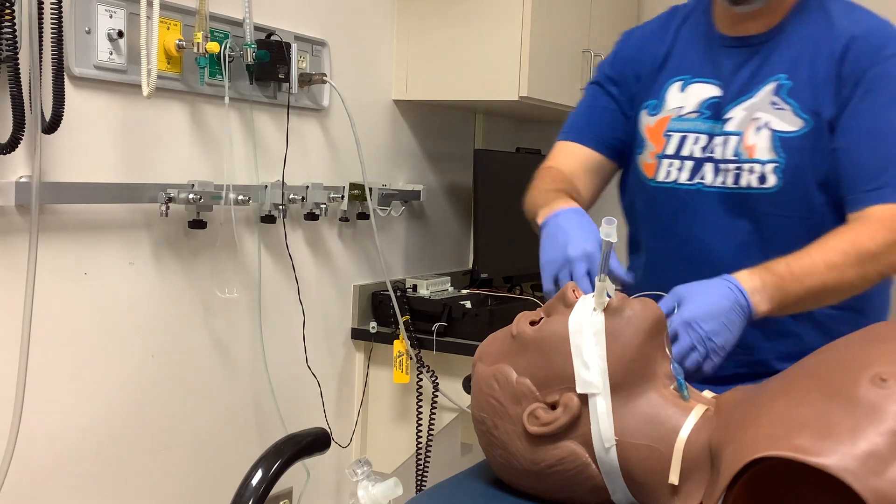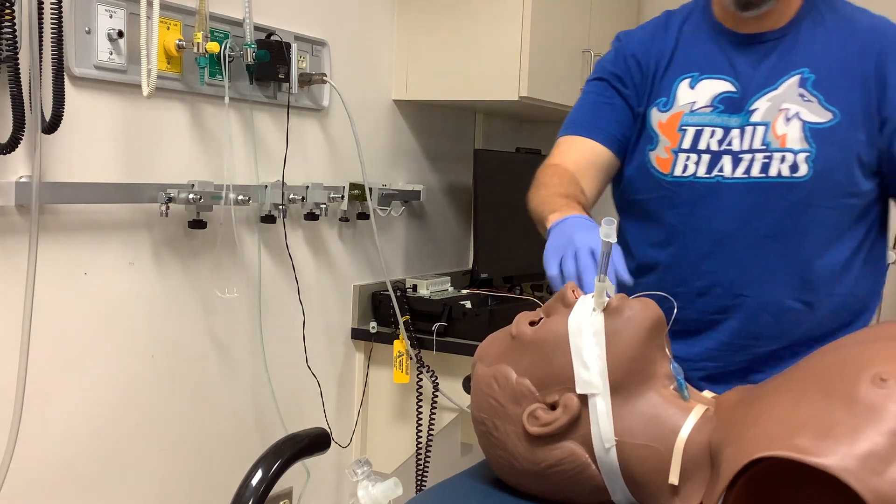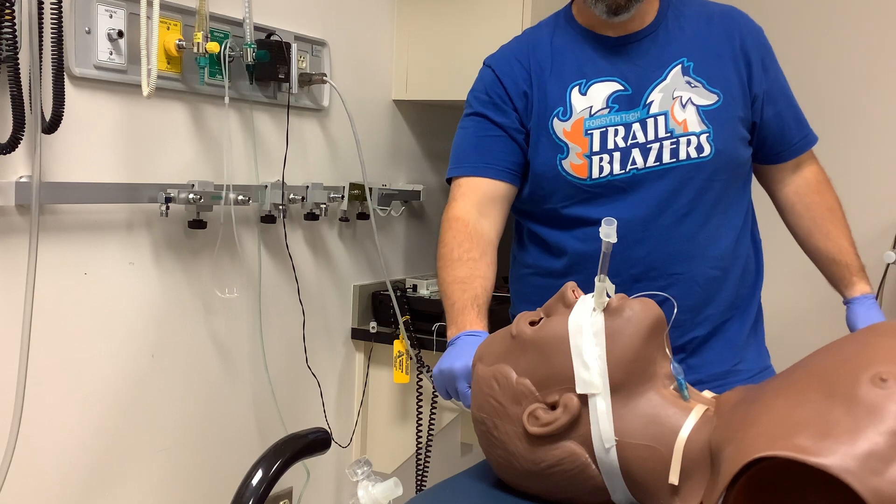It would look better if the tape actually stuck on this mannequin, but that's how we go about securing an endotracheal tube. Thank you.